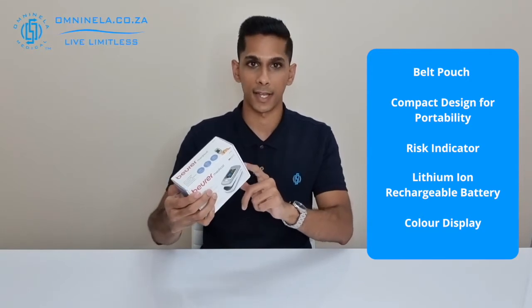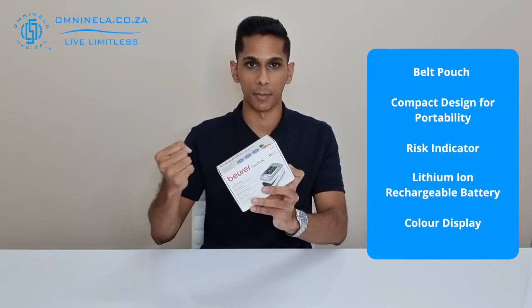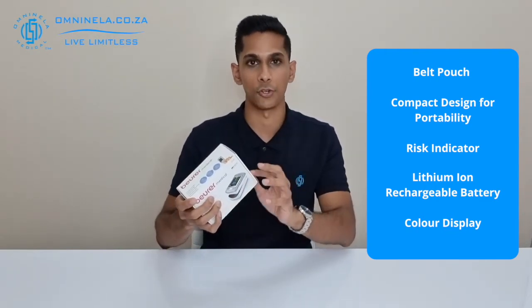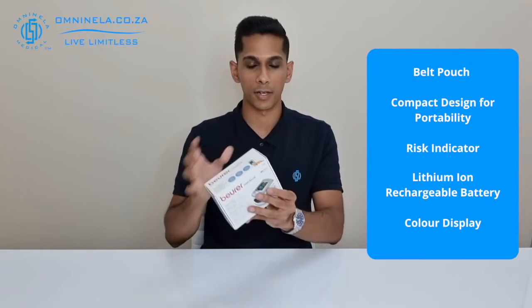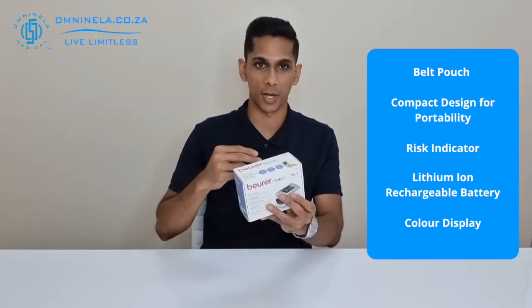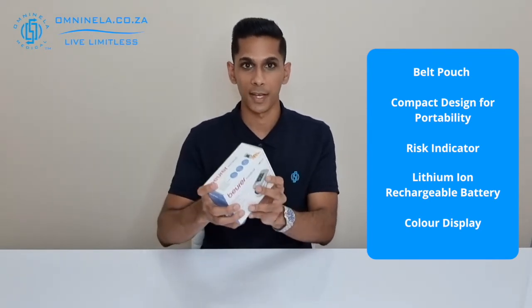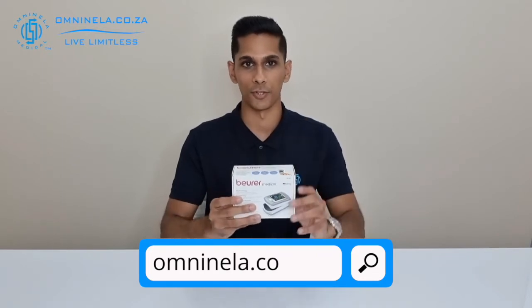With this device you've also got a retaining strap which will allow you to move around with it, keeping it secure, and you've also got a belt pouch with a belt strap so that you can hook it onto your belt if needed. This device also has a five-year guarantee, so if there are any manufacturing defects within the next five years of purchasing it, we'll be able to help you out. Let's have a quick look at the items that come inside the packaging.